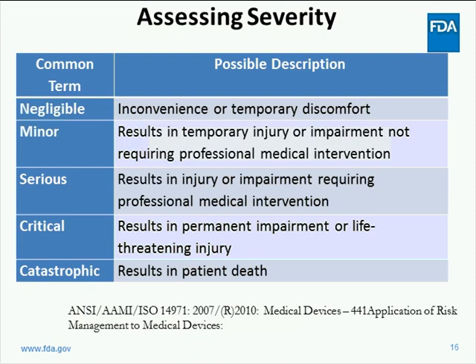With respect to the assessment of severity of patient harm on the x-axis, manufacturers should already have processes and experience for assessing the severity of impact of device defects on patients. Shown here is a suggested approach from ISO 14971.